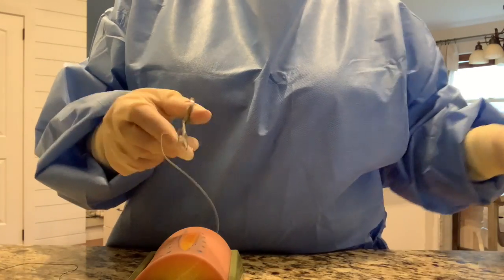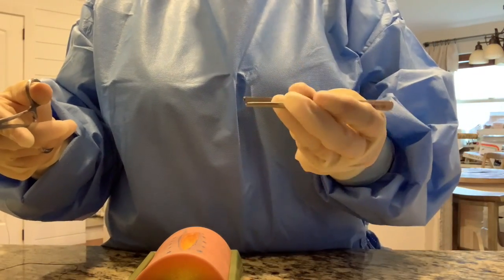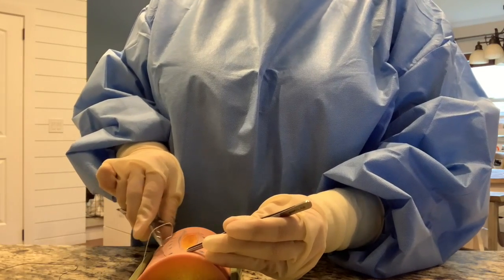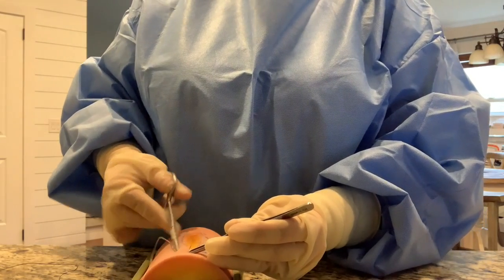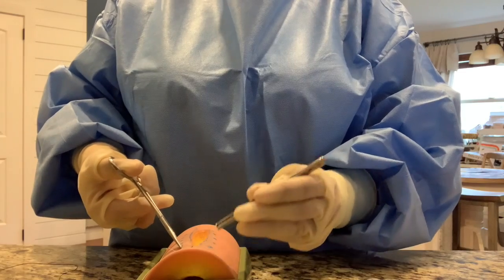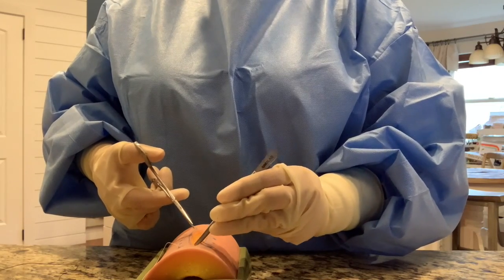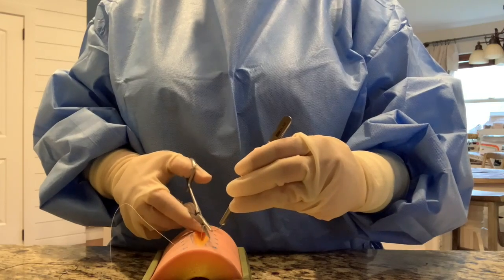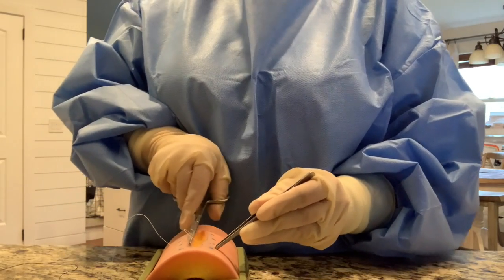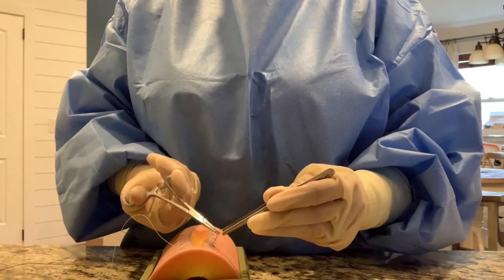Once our suture is properly loaded onto the needle driver, we are going to start. Grab our forceps in our other hand, and we are going to grasp our tissue and place our first bite - just grabbing the dermis and the epidermis, no fat. I angle it through. We are going to grasp the needle and readjust our needle driver. Then go ahead and make your other bite. It's really important to have your interrupted sutures evenly placed to hold the wound closed properly.